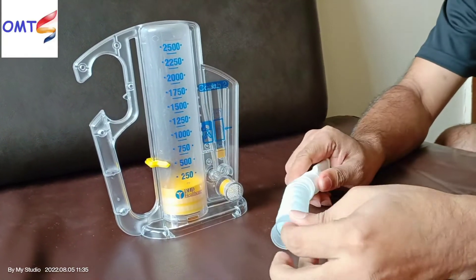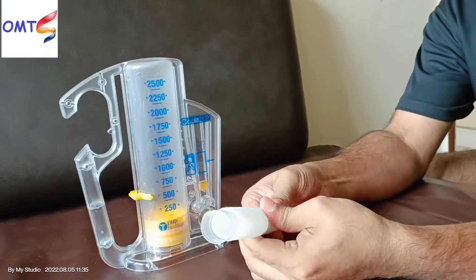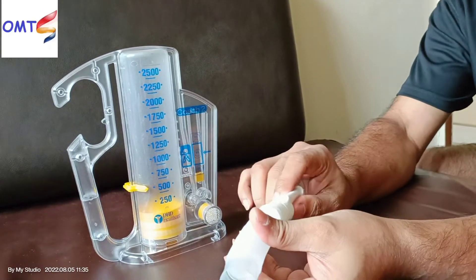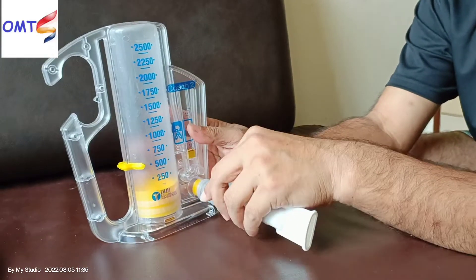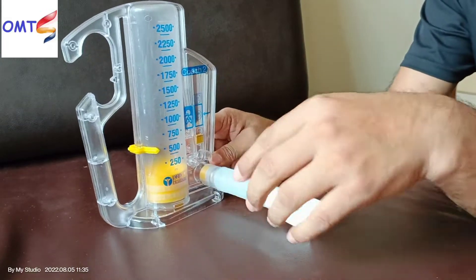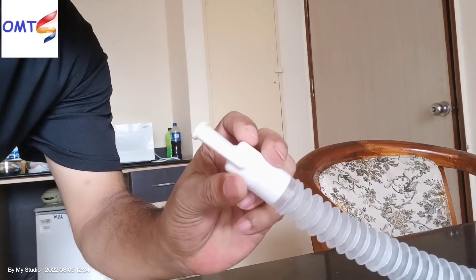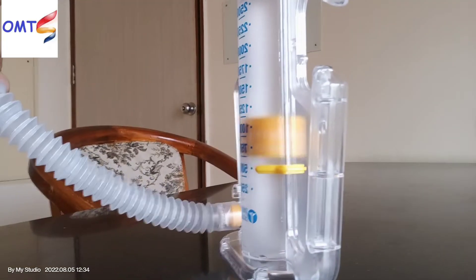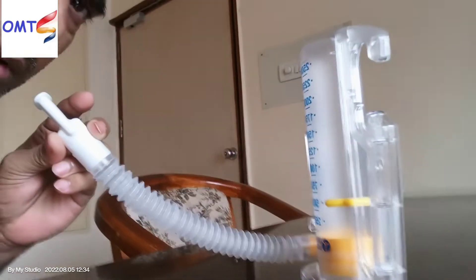This is how we unpack and set up the machine. We have to unpack the entire machine carefully. Let's see how the machine looks now. You can see the machine on the right side — it is set up on the right side.